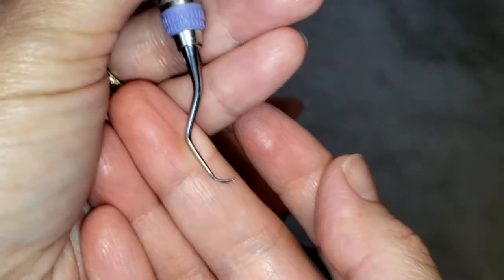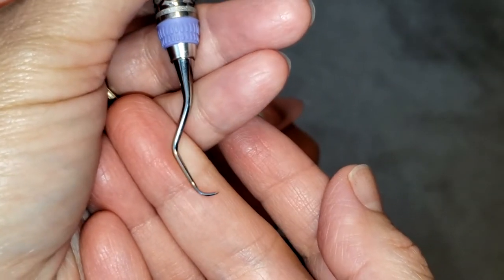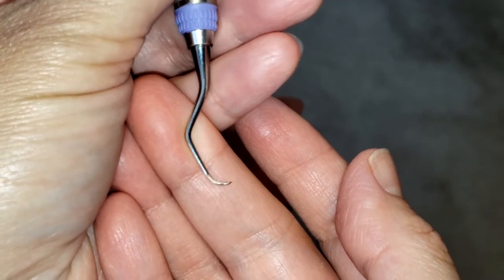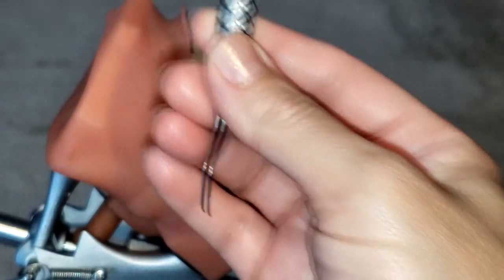With this instrument, it's very important that we are making sure we are establishing the correct end on the tooth, otherwise it will be useless. So now let's get to it.